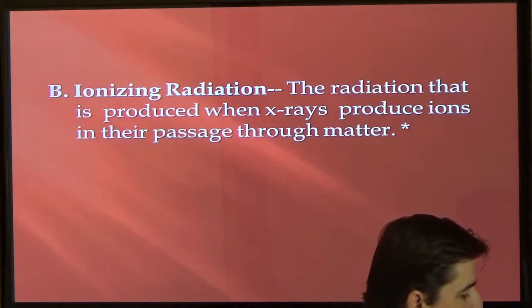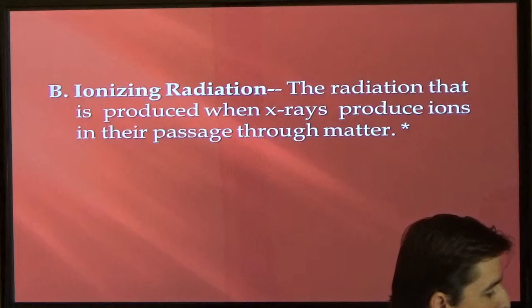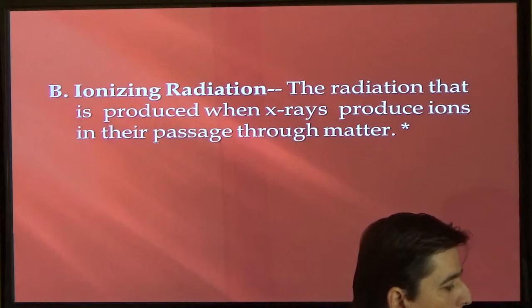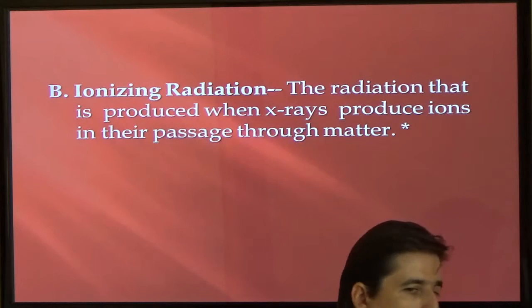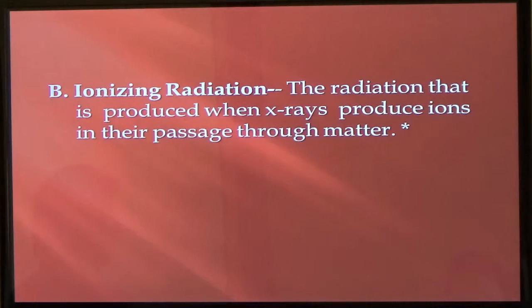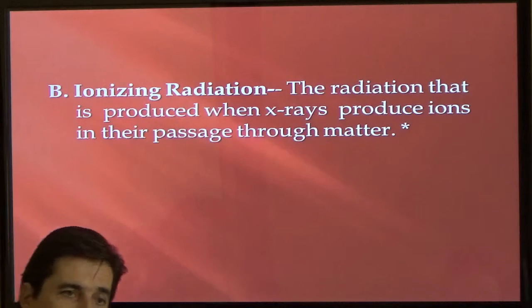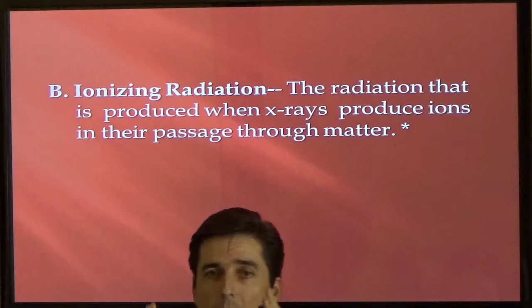If you've got an X-ray coming through here, you've got the primary beam of the X-ray. It hits tissue or skin or something, and it causes a change. The cells have a certain charge, positive or negative. When the X-ray hits them, it's going to cause a change to those cells.